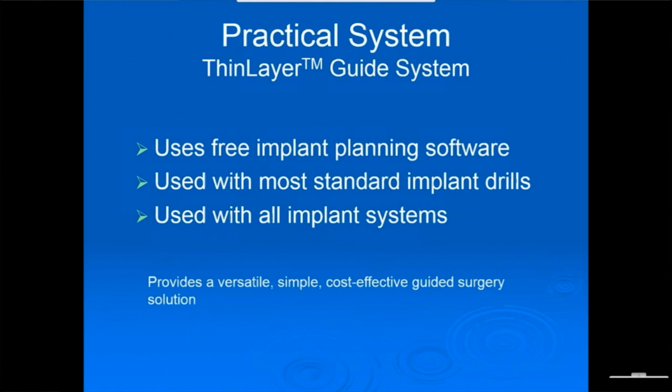The system is a practical one. It uses free implant planning software, the Blue Sky Plan software. It can be used with most standard implant drills and can be used with all implant systems. In summary, it's a versatile, simple, cost-effective guided surgery solution.